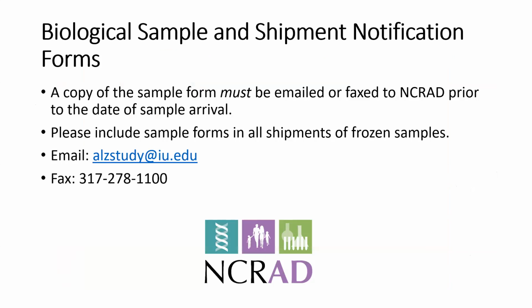Again, a copy of the sample form must be emailed or faxed to NCRAD prior to the date of sample arrival. We do ask that you include sample forms in all shipments of frozen samples. And again, we've provided our email and fax number for you to send those to us.